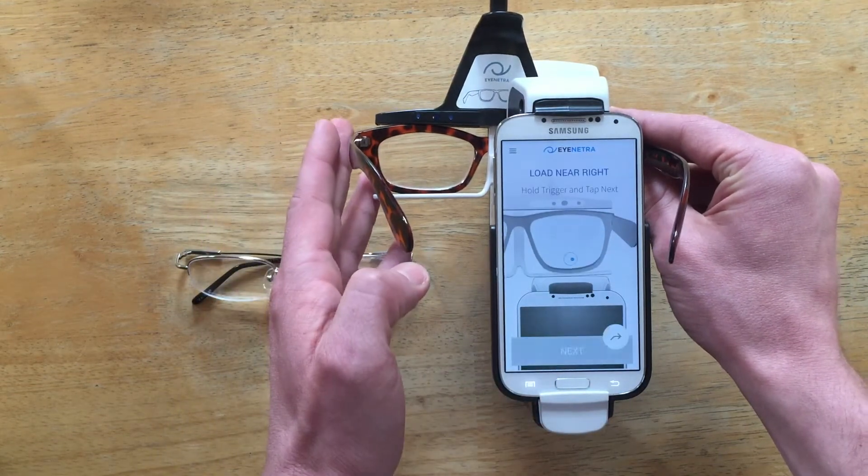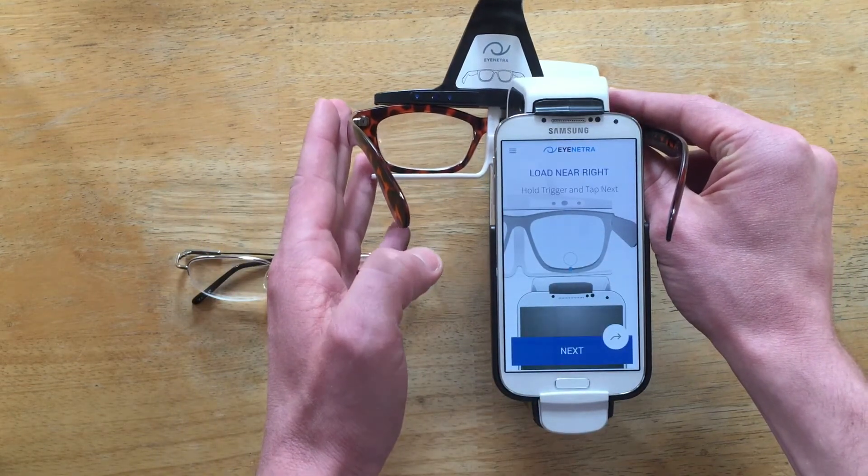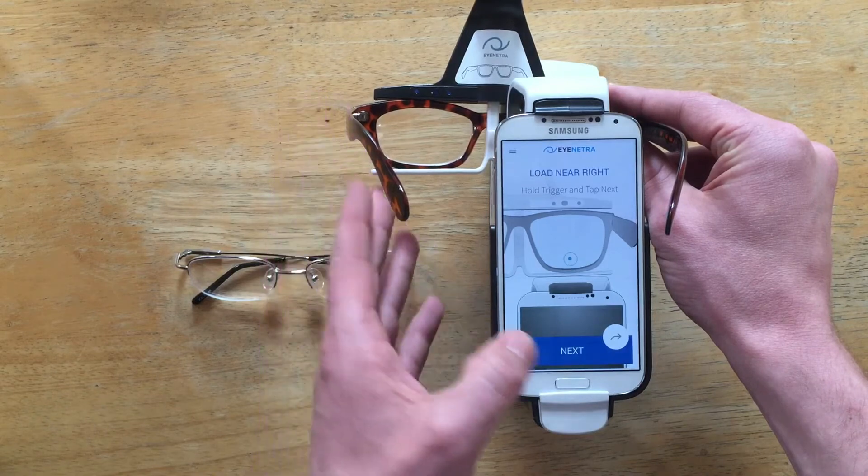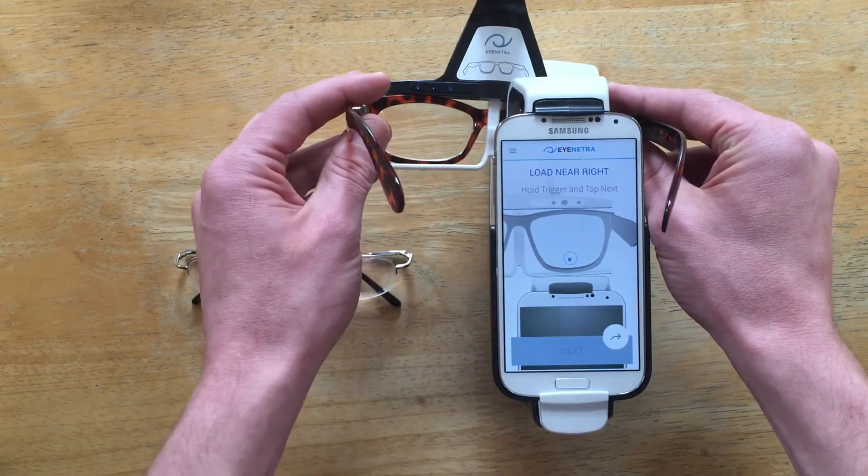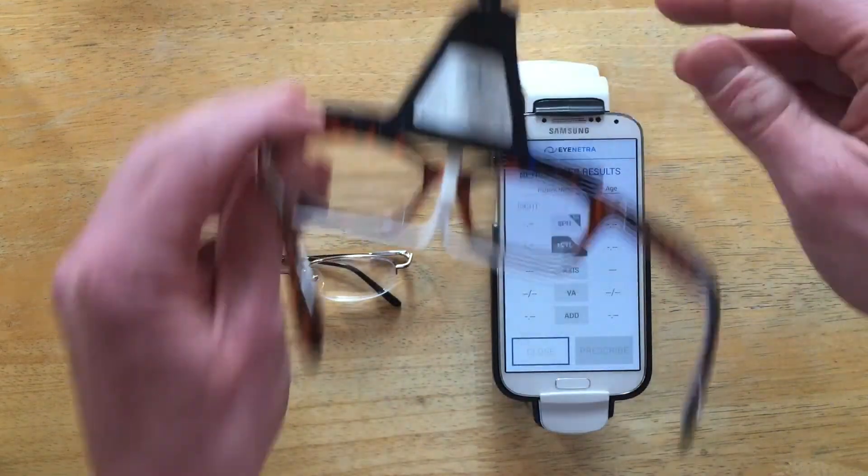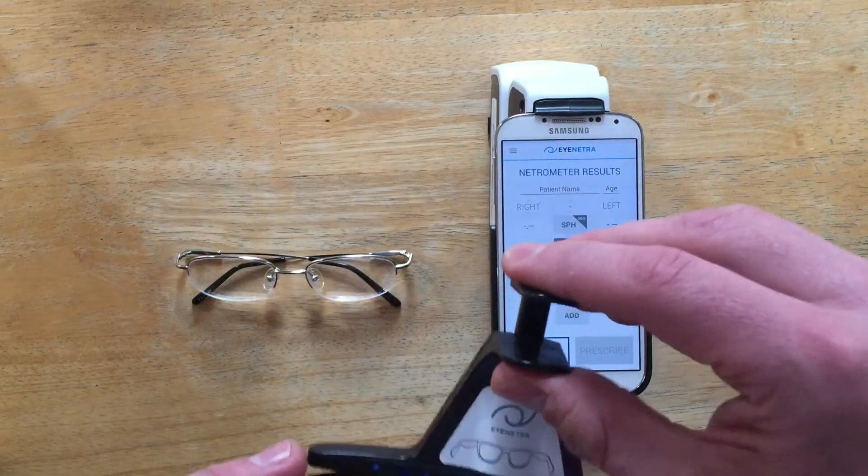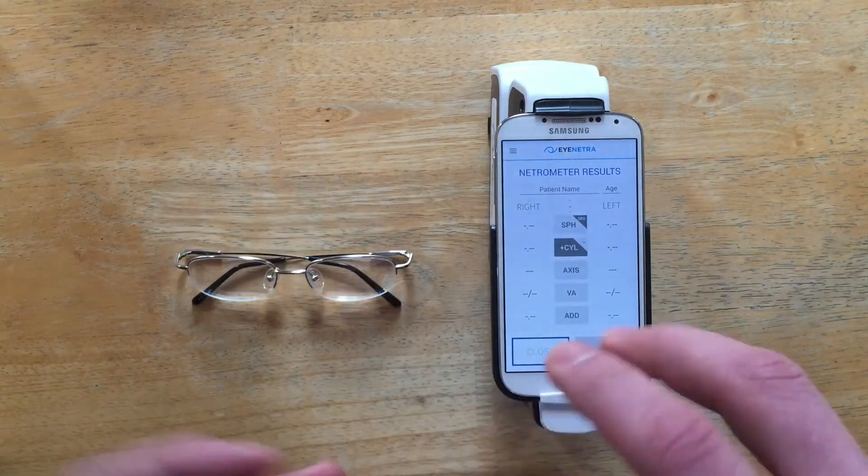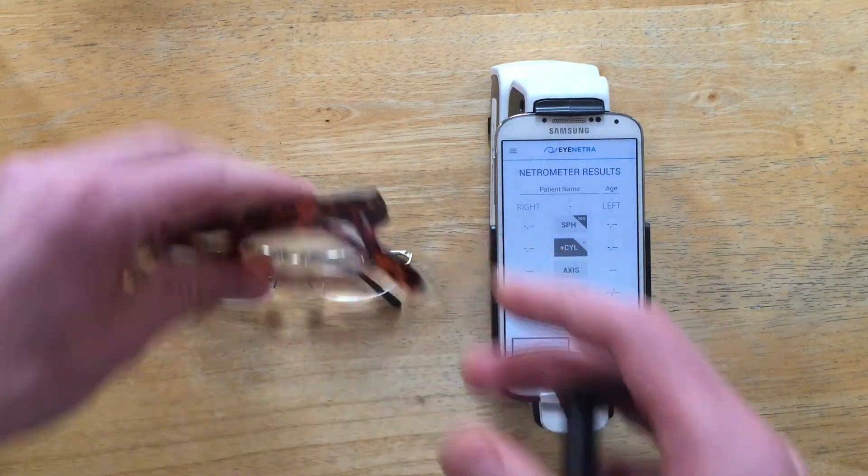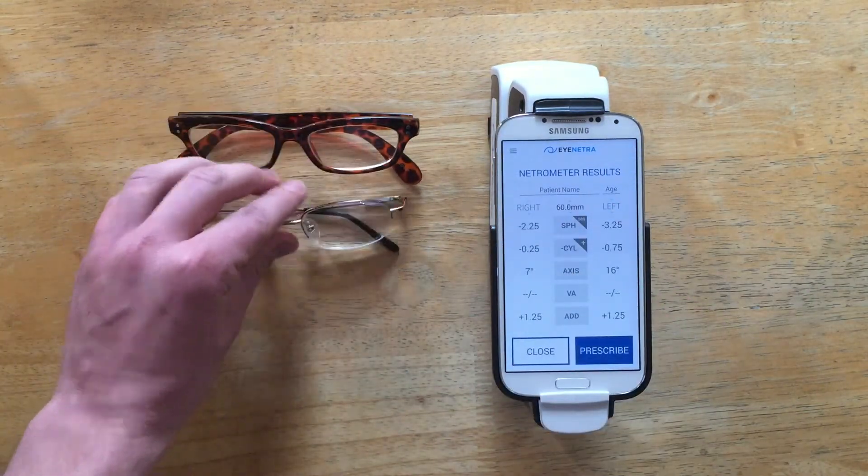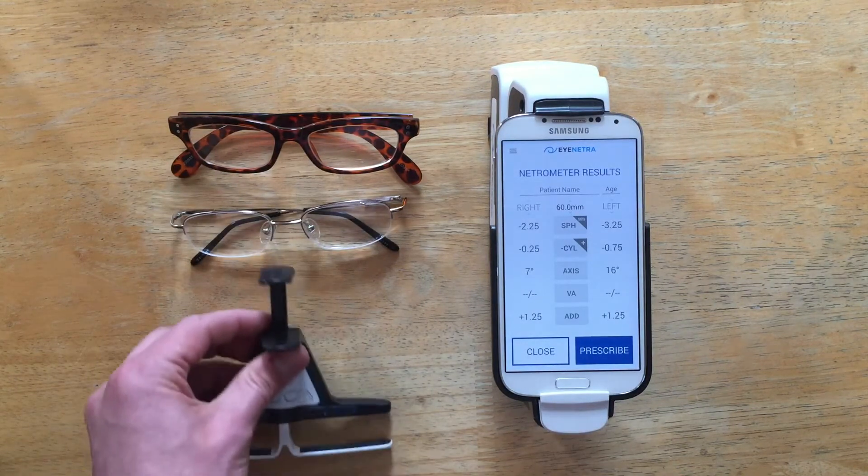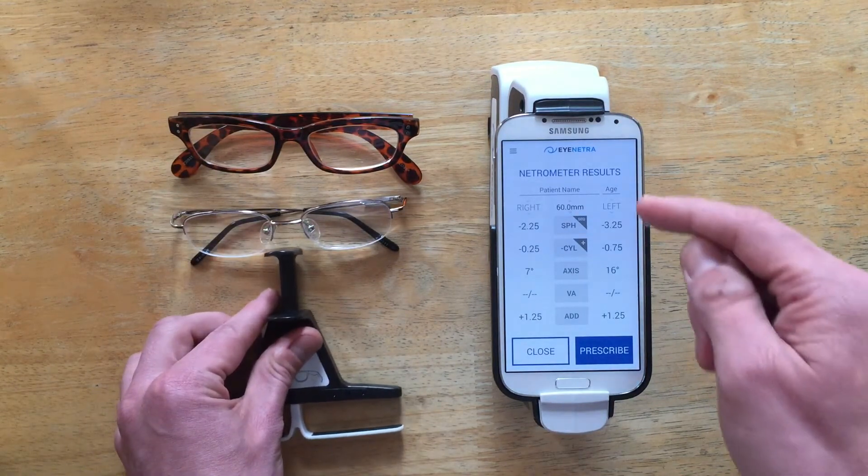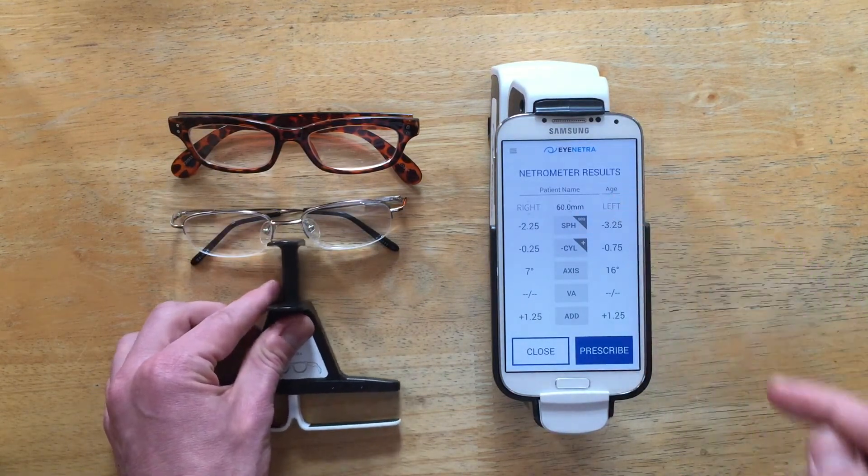And once more. Great. That was easy. And as you can see, we now have a PD measurement included as well.